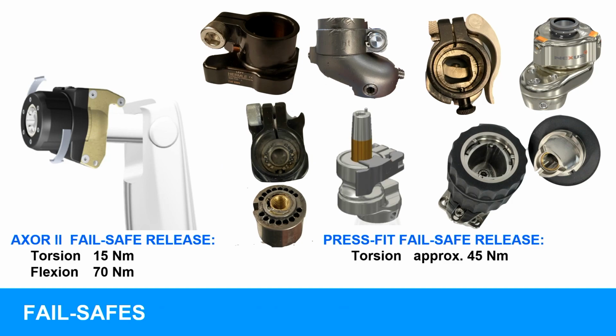Fail-safes. Most of these connectors have a fail-safe. I think the University of Utah is the only group that says we do, and maybe it's been changed, but they don't need a fail-safe device. They haven't found it to be necessary for their POP system. But the Axor 2 has 2 fail-safes, one in the transverse plane to minimize rotational forces, or to break away if there's excessive forces.